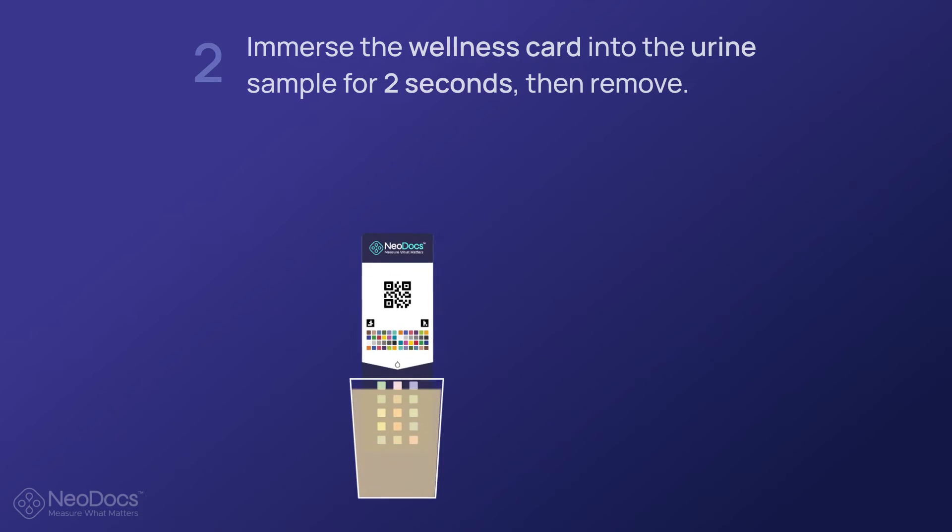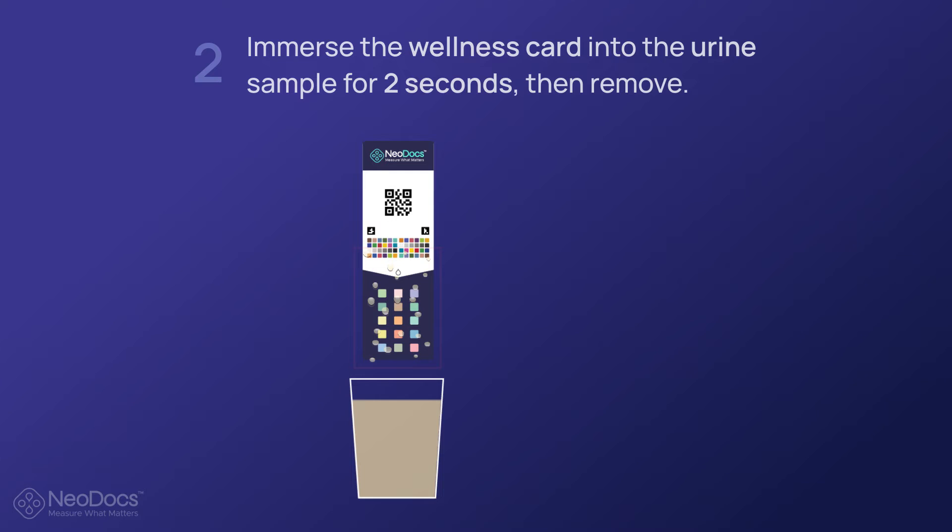Immerse the wellness card into the urine sample for two seconds, then remove. When immersing the card into the sample, make sure the black area is dipped completely.